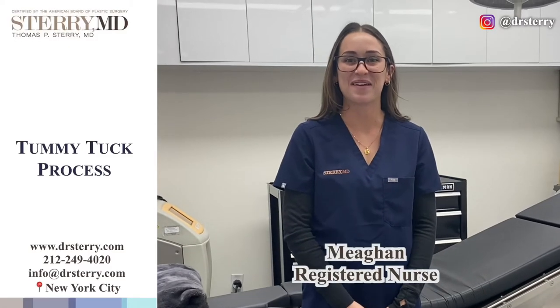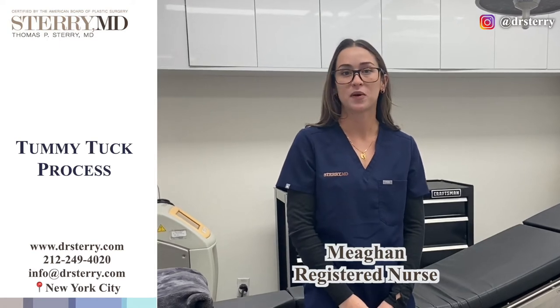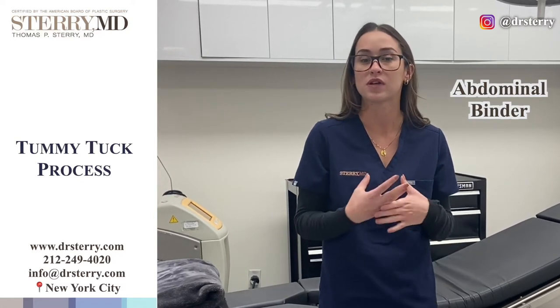Hey everybody, my name is Megan. I'm the nurse here at Dr. Sari's practice. The team and Dr. Sari just wanted to make a series of videos to walk through the tummy tuck process and how to care for yourself post-operatively. So the first video today is going to be about the abdominal binder and how to properly wear it and different steps along the way.